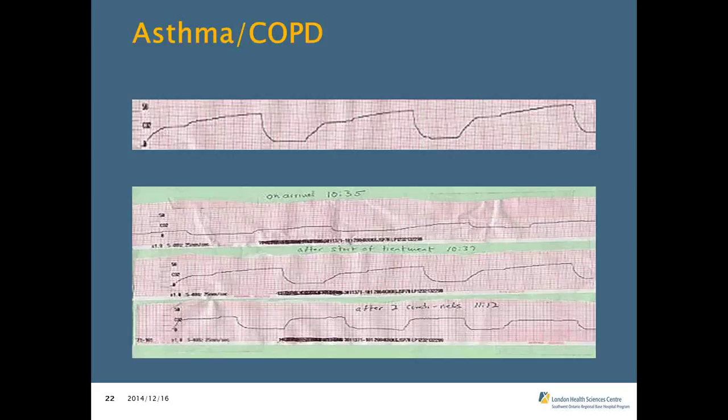So they're having that prolonged expiratory phase, which is the hallmark of an asthma exacerbation or a COPD exacerbation, which is why you're getting that very long plateau. And typically, a COPDer tends to run a bit higher CO2 on a good day, which is why they're going to have a higher level of expired CO2 being measured.